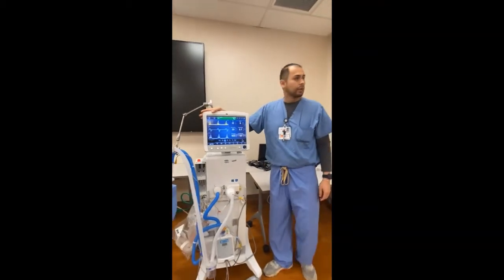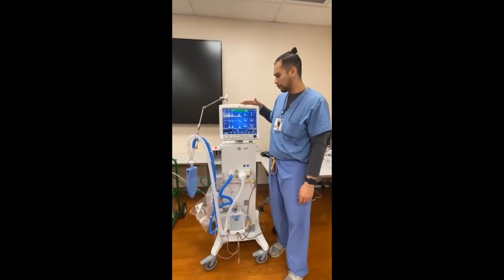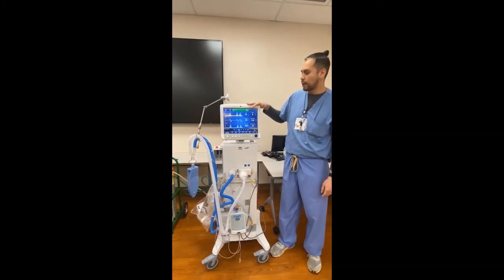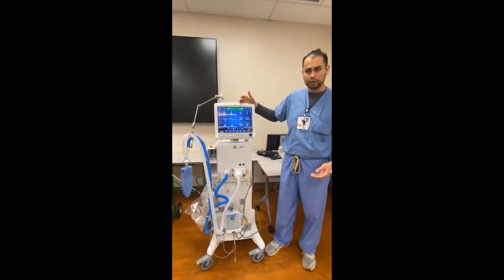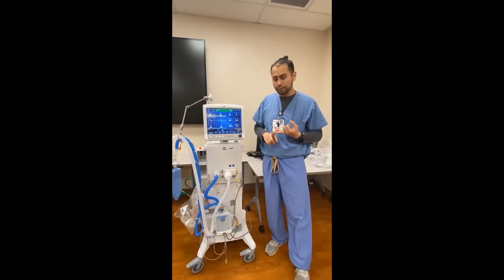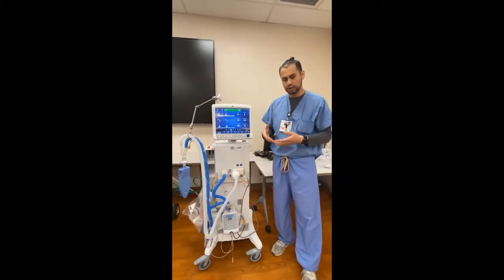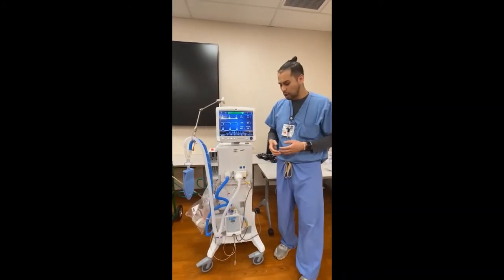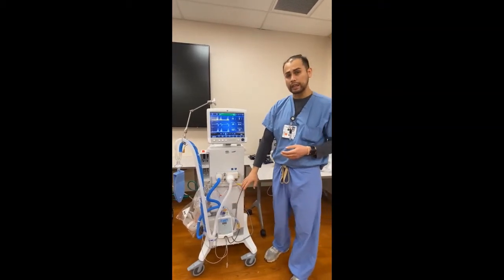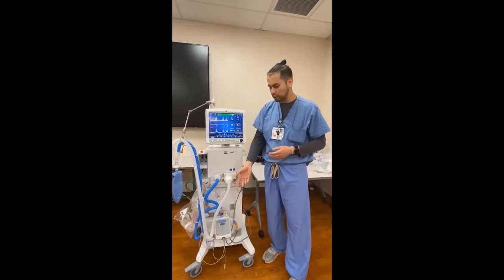Now on the ventilator, we have a couple of complications that I will discuss. We tend to come across the most common complication, which is high peak pressures. Elevated peak pressures can mean a lot of things: increased secretions, the patient waking up and giving inspiratory effort, an occlusion or kink in the line causing an obstruction in the airways, or water buildup in here due to condensation because we are providing heated air. The water will be sloshing around in there and we need to drain it.